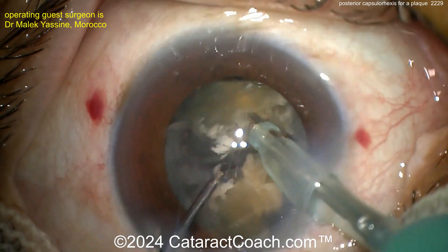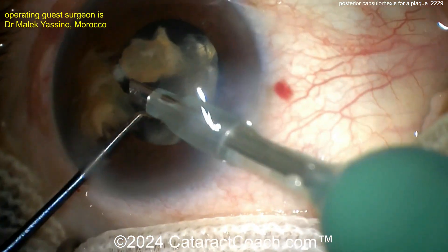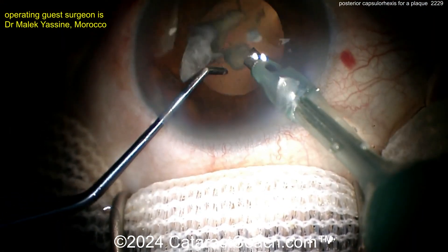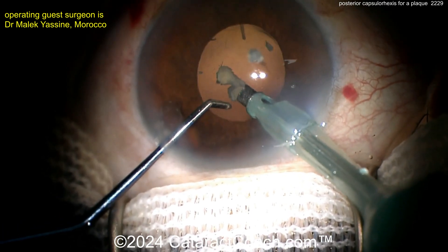Last chop here, get the nucleus done. Let's see what's back there. There's probably not going to be a whole lot of cortex. Remember, denser nucleus means not much cortex left. Be careful as the last few pieces come up — you don't want to nail the posterior capsule. Good job here. Last few pieces come down.